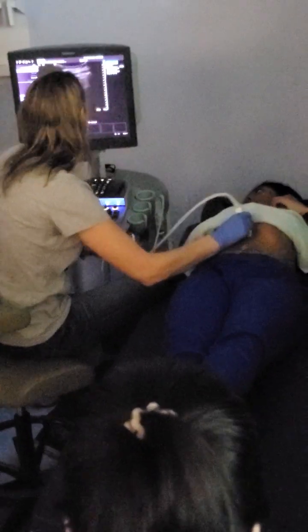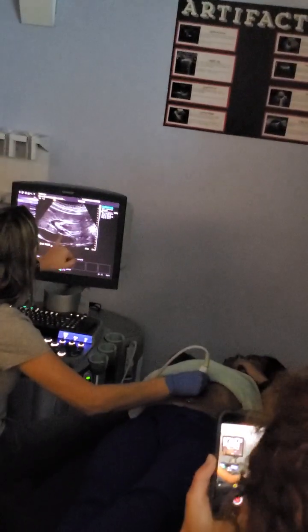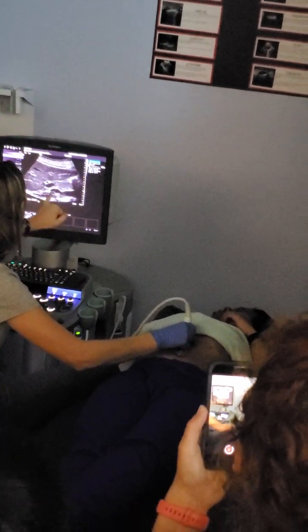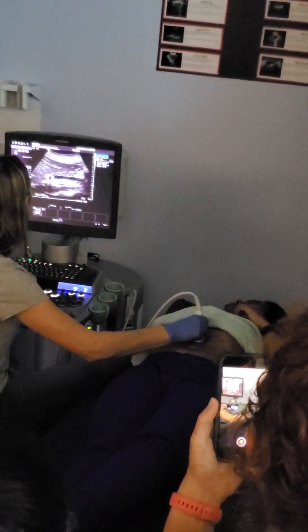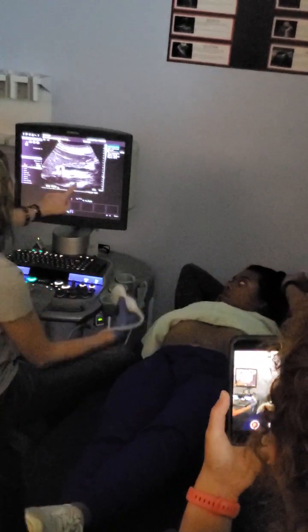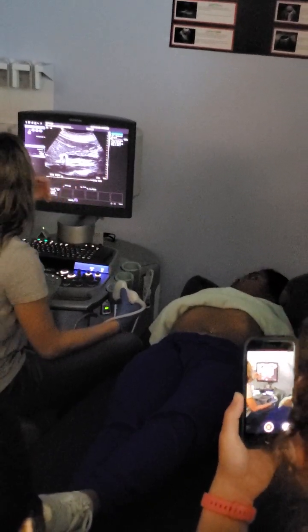So go ahead and breathe in. What I do is find that portal splenic confluence. If I go in the liver, here it is crossing the IVC, so I know it's the portal vein. And now I'm going back towards her left side, and that will open up, and you'll start to see that SMV, IMV coming in. We're looking a little bit to the spleen, not that far over though, because if you look, this is the aorta. So we're kind of just off the side of the aorta.